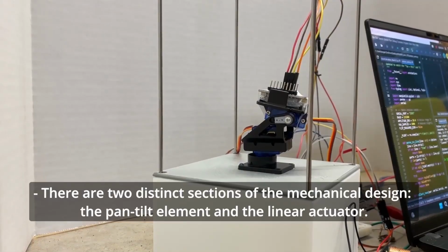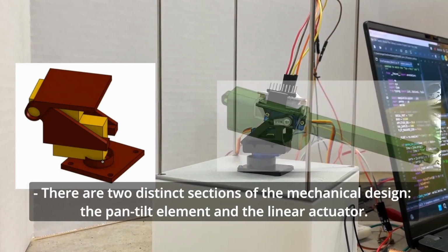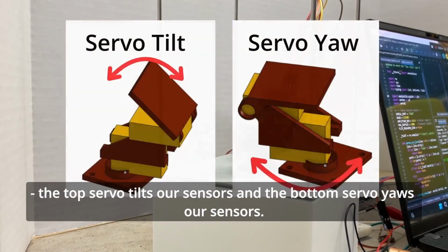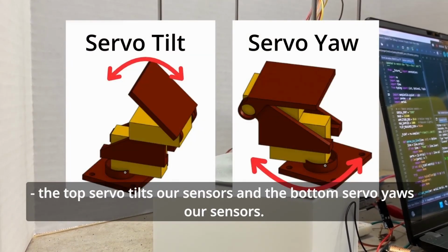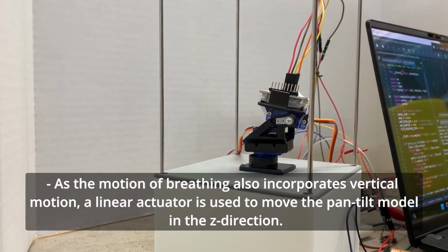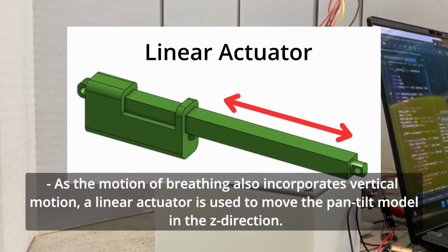There are 2 distinct sections of the mechanical design, the pan-tilt element and then the linear actuator. For the pan-tilt element, there are 2 servo motors driving the motion. The top servo tilts our sensors, and the bottom servo yaws our sensors. The motion of breathing also incorporates vertical motion. A linear actuator is used to move the pan-tilt model in the Z direction.